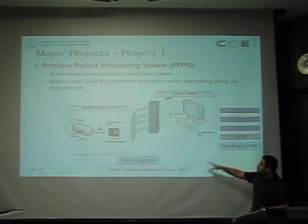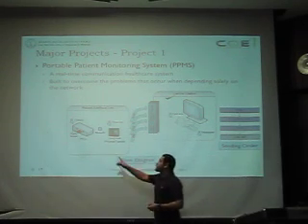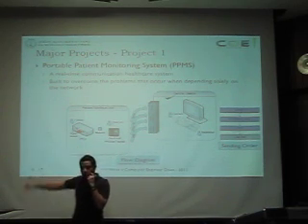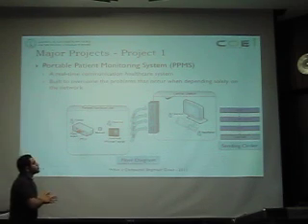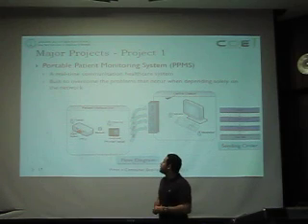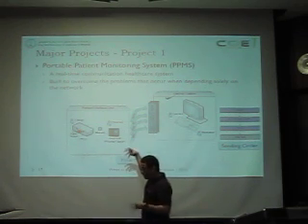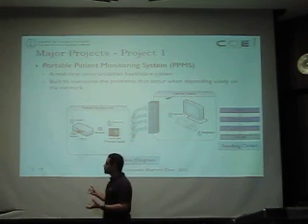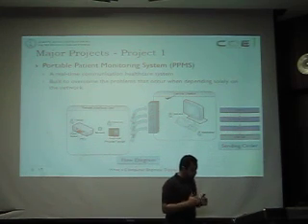This is the flow diagram. The patient can issue a panic button to indicate an emergency situation. So the central station can be alarmed. And we have an Android phone, which is a part of the patient interface unit, that we can see the sensors readings.